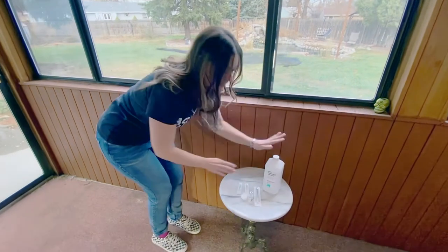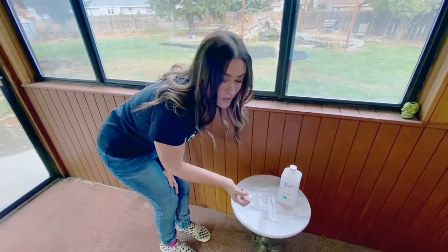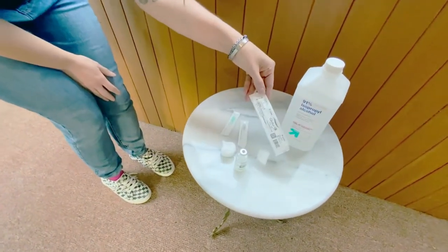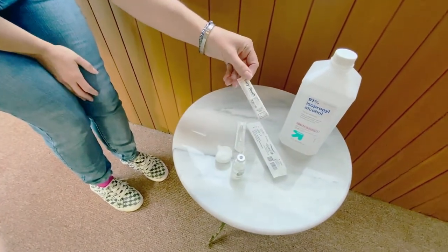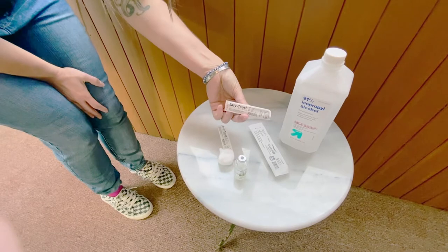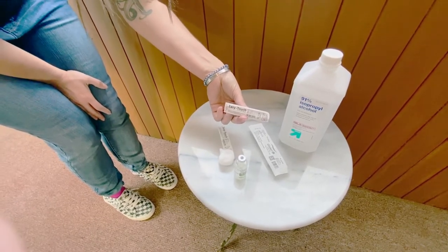So what you need for supplies: alcohol to clean your bottle and your skin, an alcohol swab, your testosterone. I'm using a 1 milliliter Luerlock syringe, a larger 21 gauge one-inch needle to pull up the testosterone, and a smaller 27 gauge half-inch needle to inject, because we're either doing a shallow delt injection or a sub-q injection.